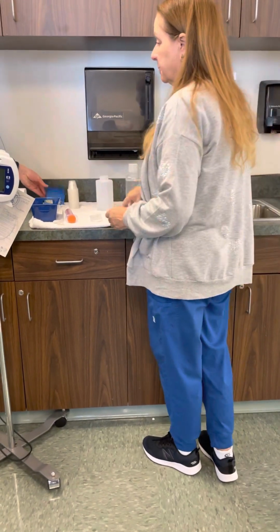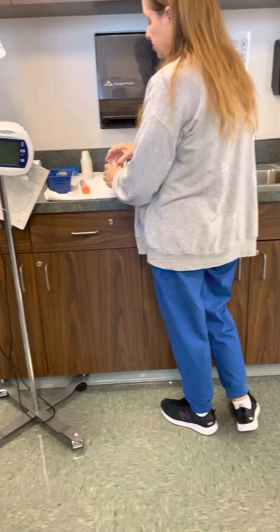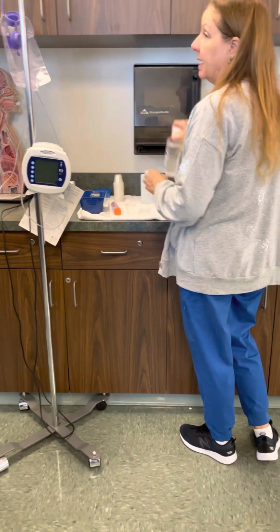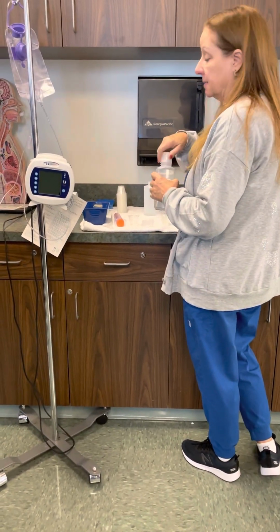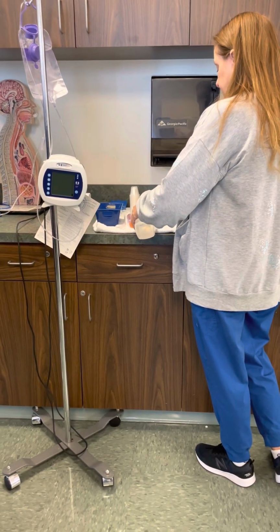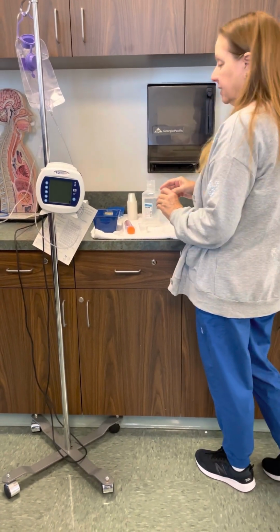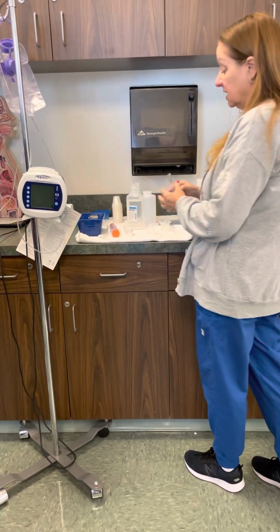And now I'm going to prepare my medications. So I know that I'm going to flush the tube in the beginning with around 30 mLs. So I'll fill this up to make it 30. And then I have my powder, and I'm going to mix that with about 15 mLs.